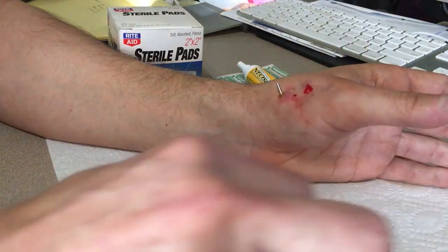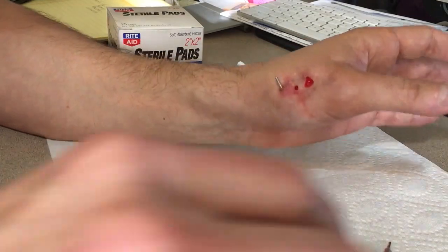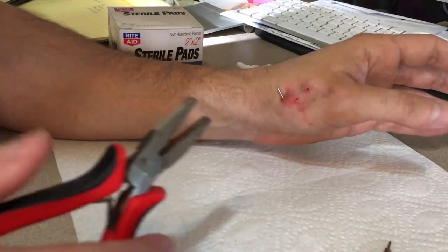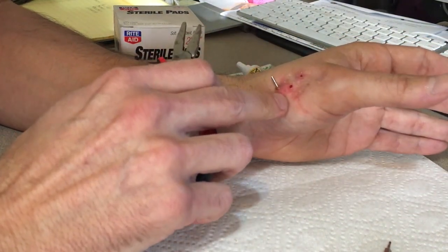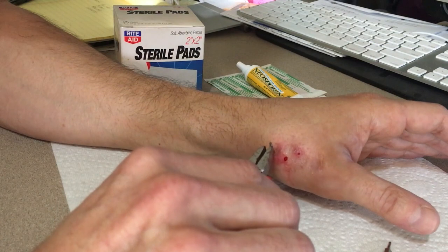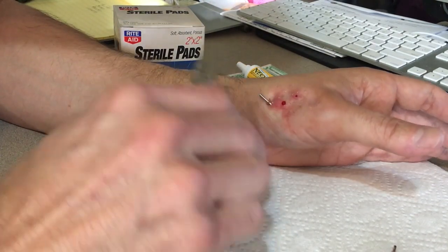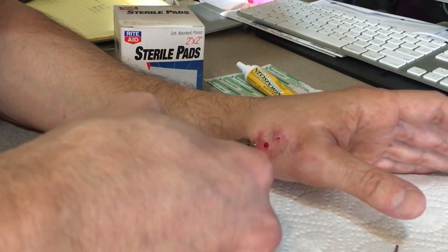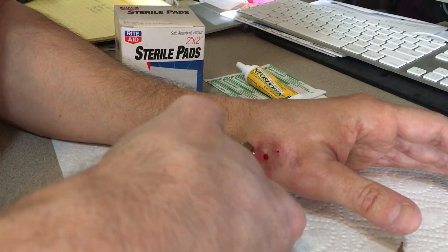There we go - that felt weird. You can actually feel it sliding along the bone. Alright, one more to go and hopefully I'll be able to move my thumb again. It looks like the joint of the pin where they bent it is actually underneath the skin. So make sure you get a good tight grip on the pin.